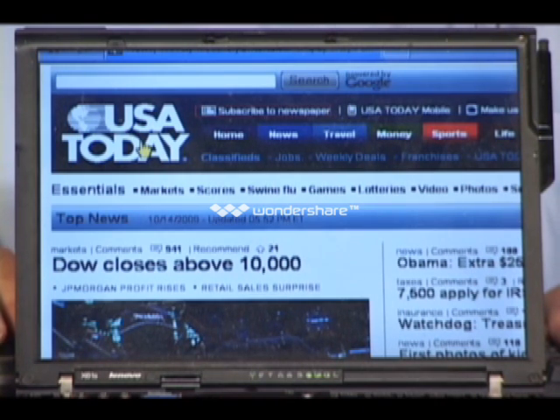And one of the features that started out in JAWS, and let me just say a couple things about that before I do this. JAWS, as those of you who were here last time know, is a screen reader. That is, it assumes that you are totally blind and you can't see the screen, so JAWS talks a lot and gives you information that you want, sometimes that you don't want, but it gives you information off the screen. Magic, on the other hand, assumes that you have some vision and that what you need is the screen enlarged and the contrast changed, all those other things to happen.